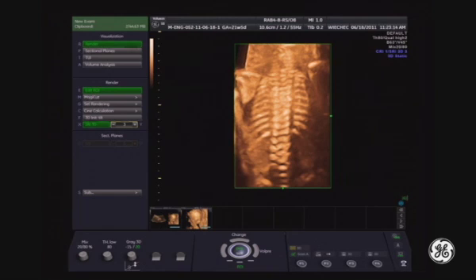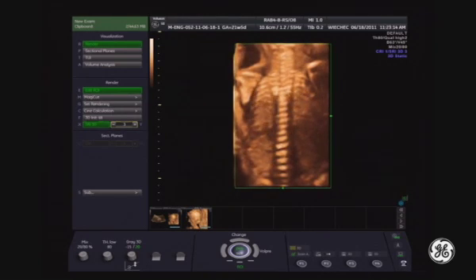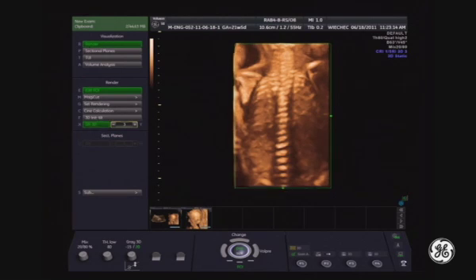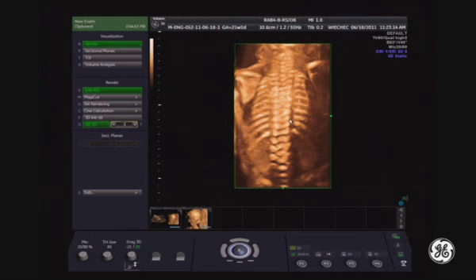This is the first method. You can change the layer of your rendering and go directly to the level of the fetal trunks, or go more superficial to the lamina — and here you can see these two ossification points. Let's try to perform the dynamic acquisition.